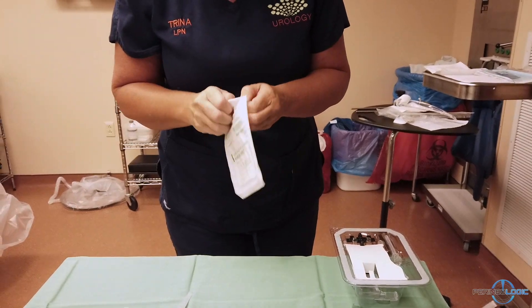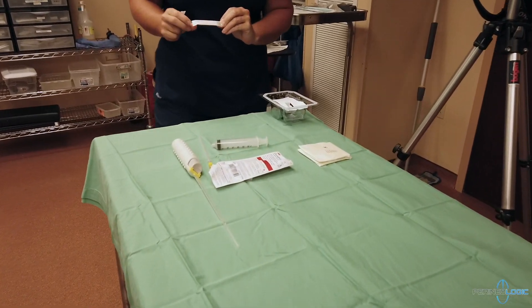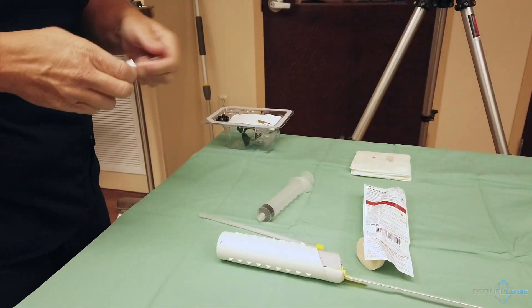Then, we will prep the gloves for the surgeon. We obtain the loading needle, which is 18 gauge by 1 inch, and this will be used to load the 1% lidocaine.